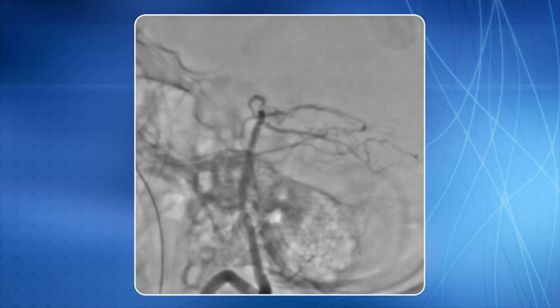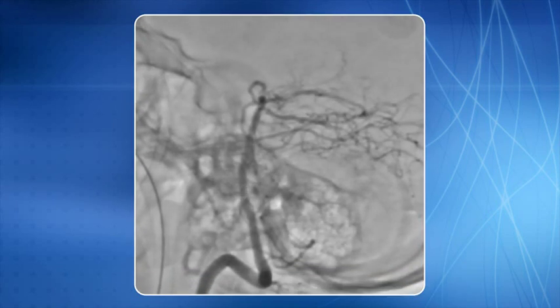Another view demonstrates the result. Note that we did not use a two-stage approach in this case because the lesion was chronic and the brain tissue distal to the lesion is usually well adapted to reduced blood supply. In chronic occlusions, you may straightaway use balloon dilatation followed by stenting in one stage.